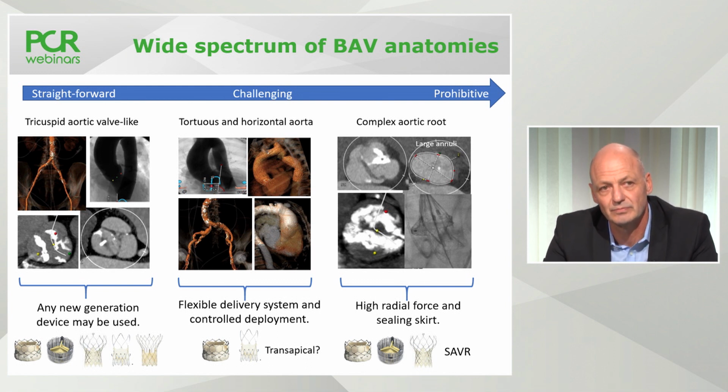Okay. And the trade-off that you're alluding to is the high risk of paravalvular leak if you don't push the calcium aside. Equally, a slightly increased risk of annular rupture when you use balloon expanding technologies. That's the bad side of the calcification. Here annular injury is more common, but you know this also. That doesn't matter if you also use a self-expanding valve. You have to open the valve beforehand, and you have to do a pre-ballooning at least to find some space for the self-expanding valve, and this also has a risk.